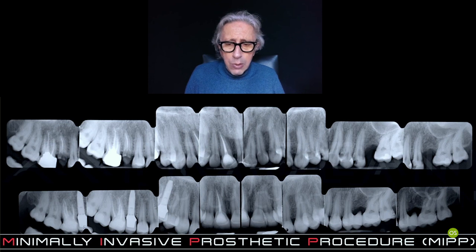So we just extracted one tooth on the upper right side, a bicuspid was retracted, but we had the chance to fix the problem everywhere, with big decays all around. We had the chance to avoid any devitalization thanks to the increase of vertical dimension that was achieved this way.